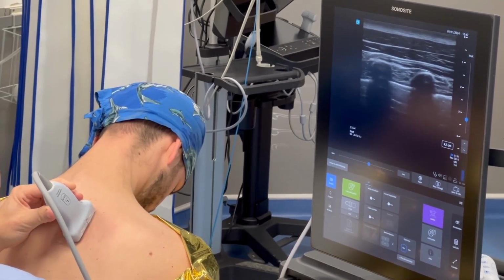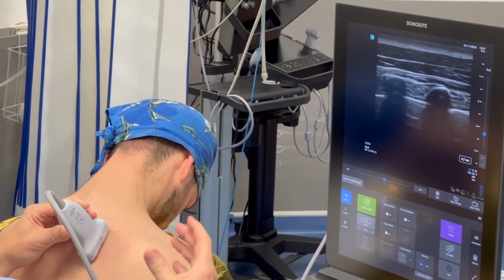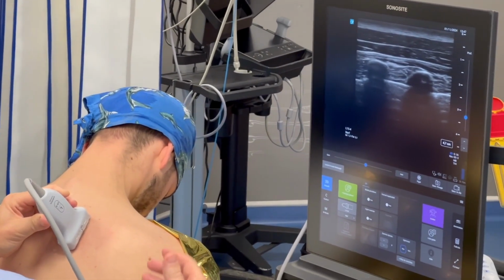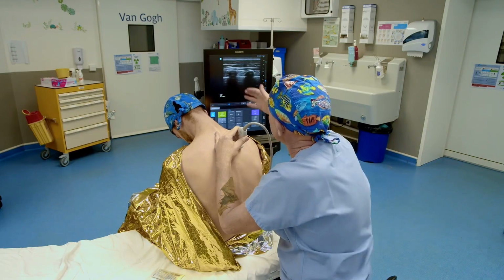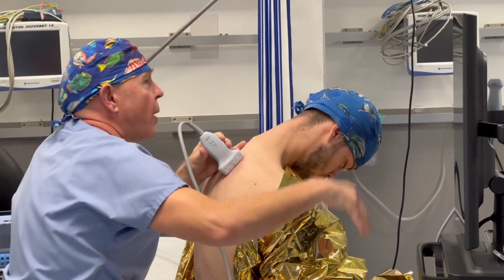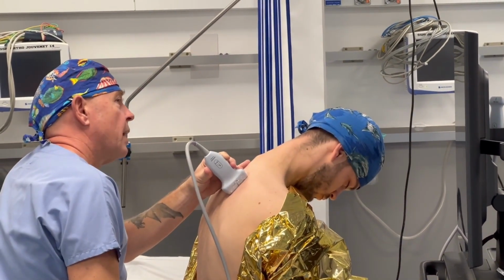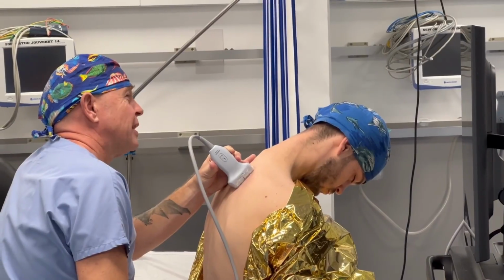Thoracoabdominal surgery, the ESP block, the erector spinae block is a very good block, for example, in cases of trauma to the wall, or for instance, for acute lumbago. And with all that, you reach only the bone and you inject the paravertebral at this level. It's still the most effective block, but it requires a bit more expertise. And here you have roughly the visualization.